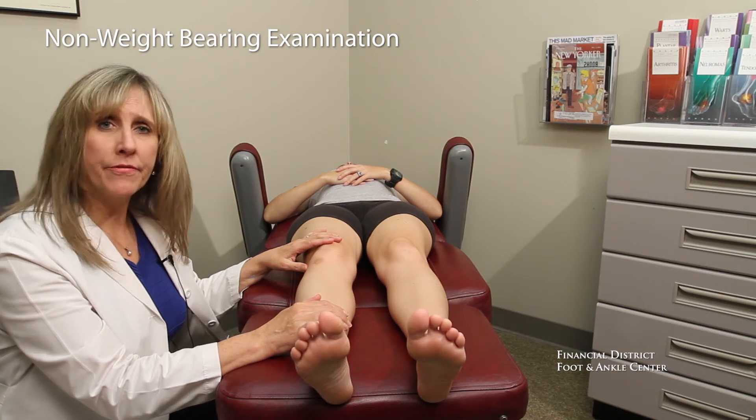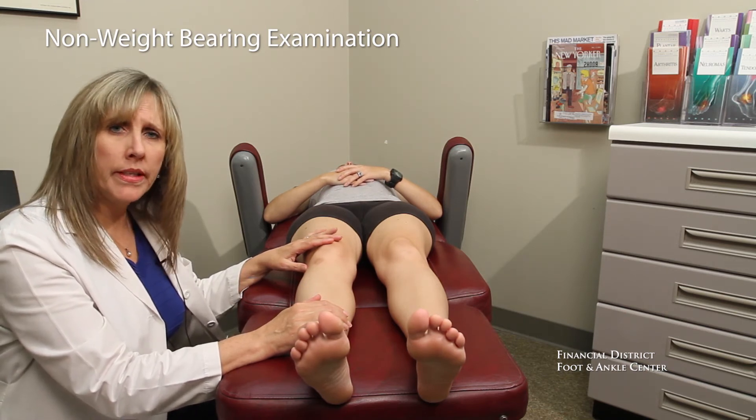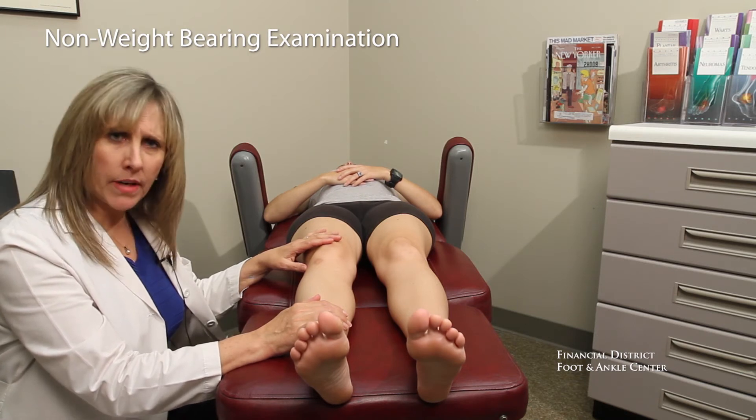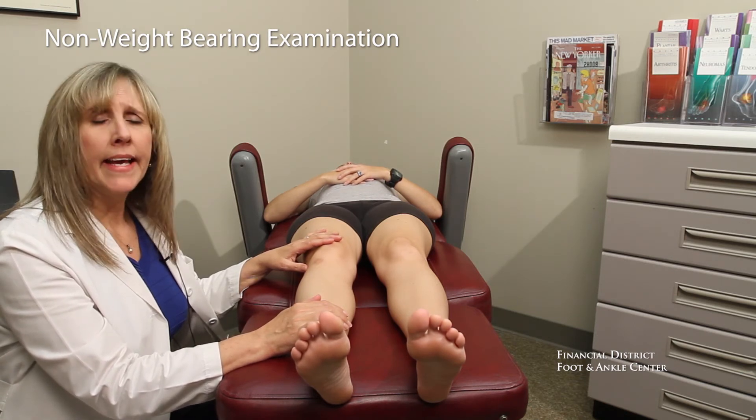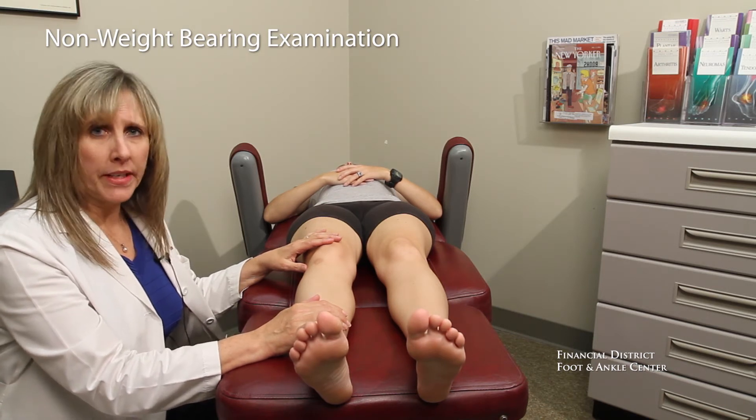We take 15 different measurements face up and face down so that we can really assess differences between the right side and the left side, and whether any differences that we find are out of the normal expected ranges.